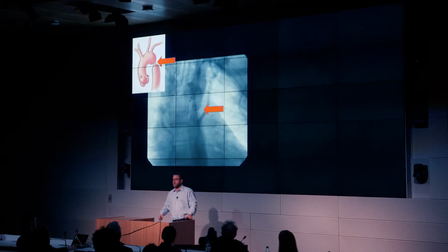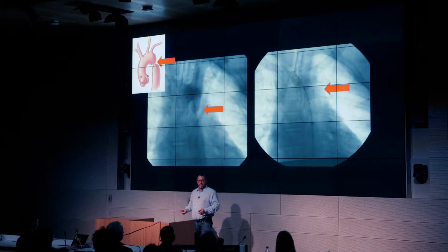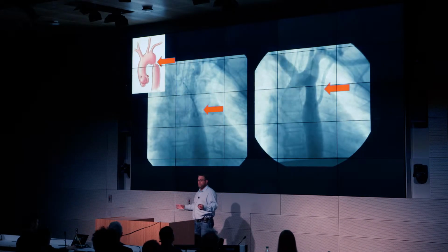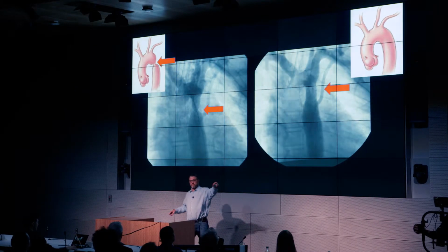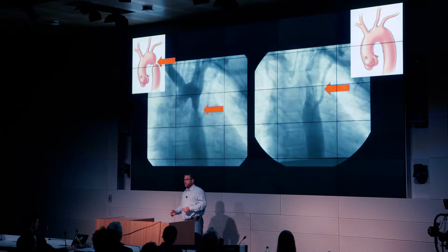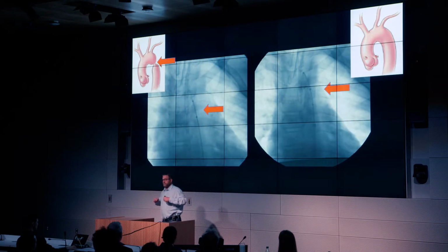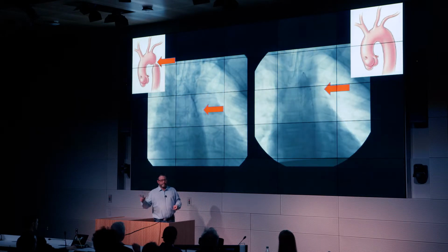Basically what I do is I come through the arteries and veins from below, and what you see there is a metal scaffolding that I put on a balloon to make that horrible obstruction in this little child's aorta perfect, so the blood can flow to the legs and all the vital organs below the neck. This is a case that went well.